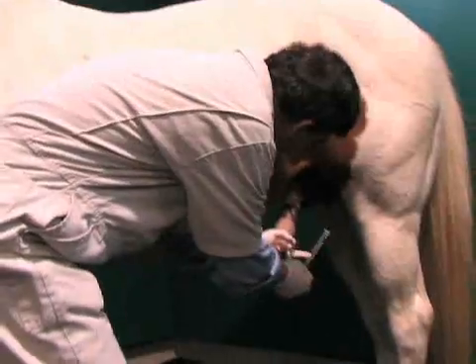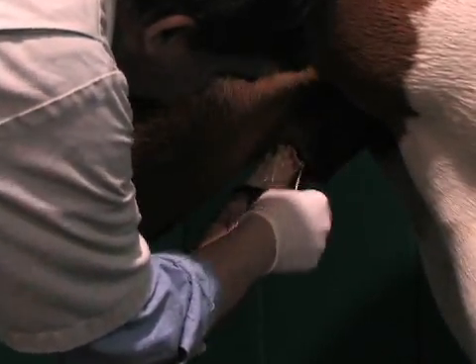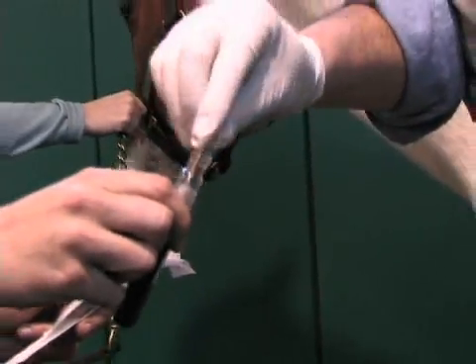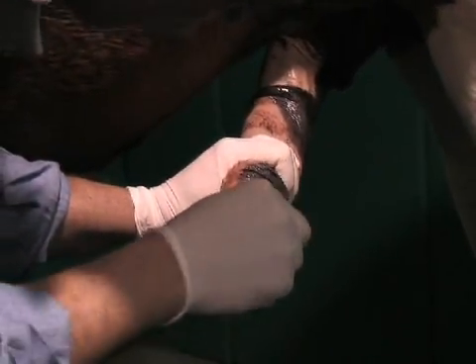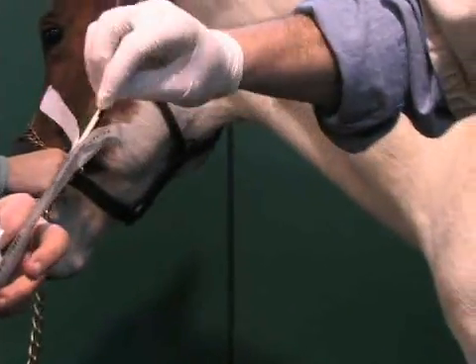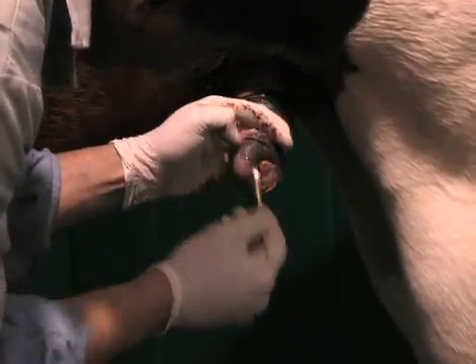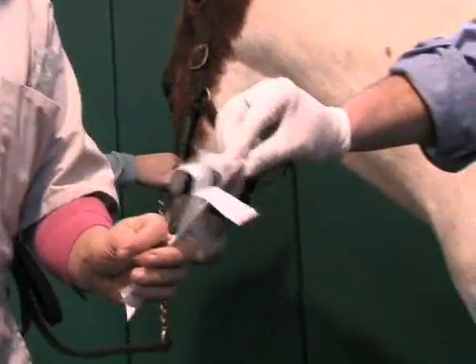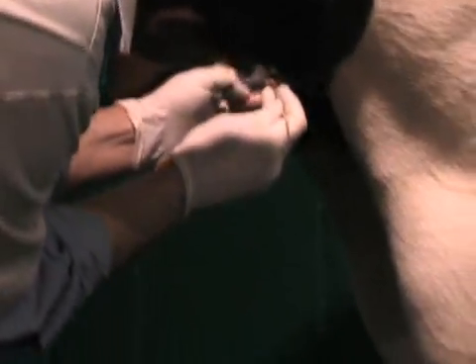Once we get the horse teased up, we can grab his penis and then the sites that we'll swab: we'll do the prepuce. We want the preputial fold here and you just get an aggressive swab — you can see when you get a good sample — and then into the Ames Media. The next sites are all on the distal penis: the tip of the urethra, the urethral fossa and the diverticulum, and then finally the urethral sinus.